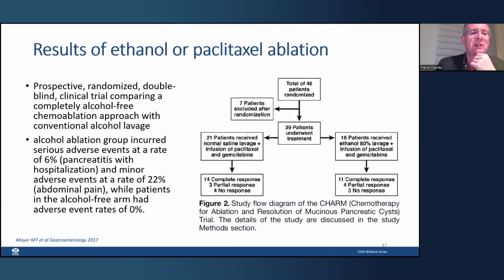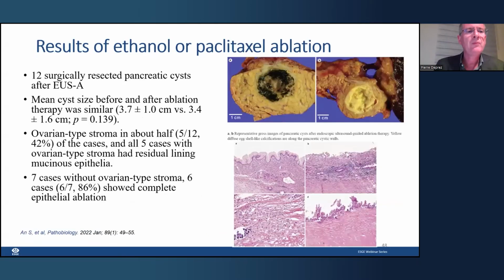You see 6% pancreatitis needing hospitalization. So the conclusion of this study is that if you use chemotherapy agents, you might not use ethanol, of course. Be aware that ethanol should only be injected in cysts that do not communicate with the main pancreatic duct, because otherwise there is a risk, of course, of ethanol going into the main pancreatic duct.